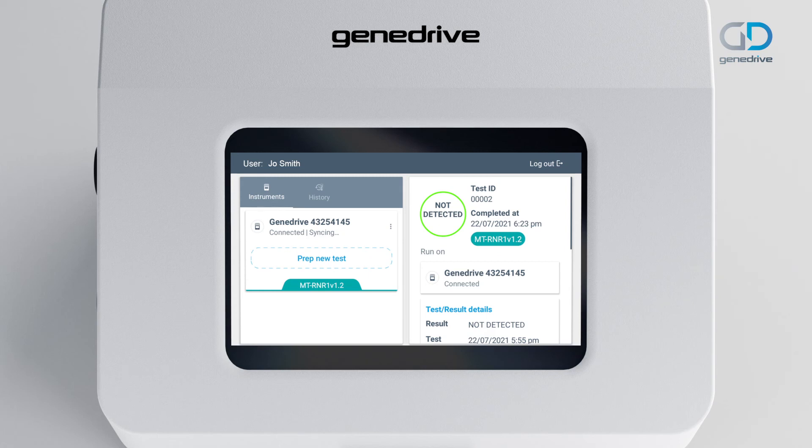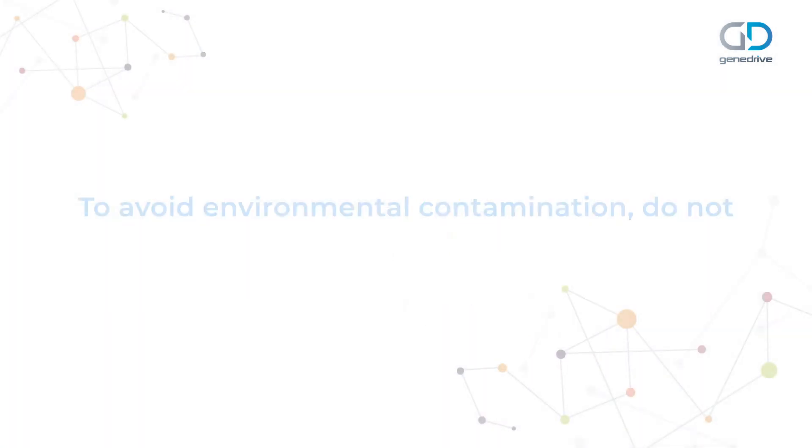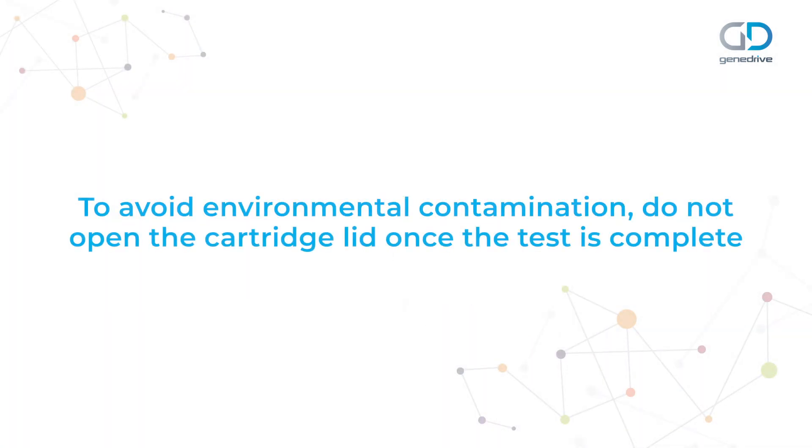If you log out, you will need to log back in to prepare a new test. To avoid environmental contamination, do not try to open the cartridge lid once the test is complete.